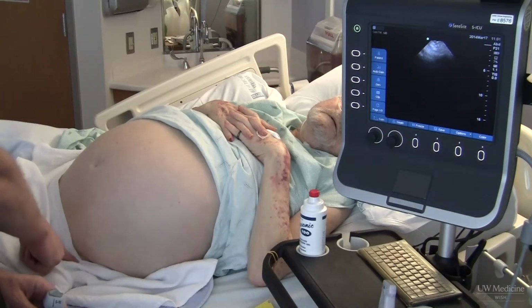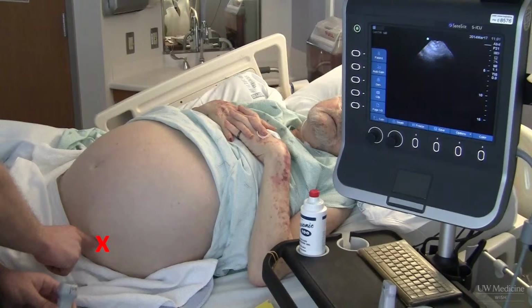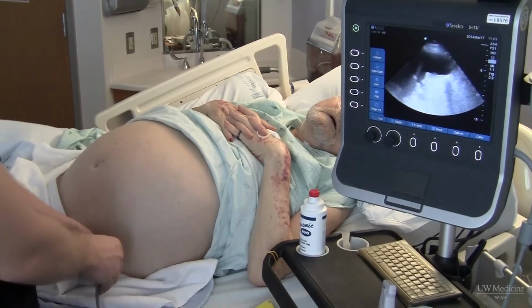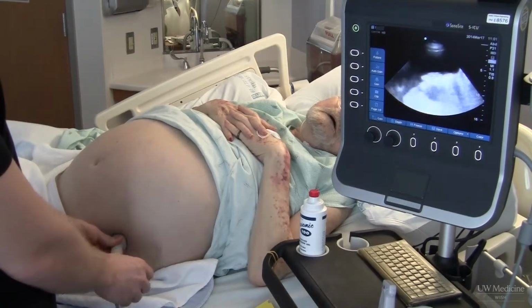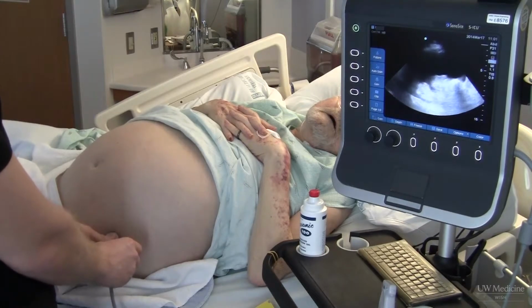If ultrasound is not available, many providers identify a spot 3 cm or 2 finger breadths cephalad and 3 cm medial to the anterior superior iliac spine. Using ultrasound, we can see that this is actually not an optimal location for this patient, with a deeper pocket of ascites visualized by moving medially and cephalad. This is one of the advantages of using ultrasound for paracentesis.